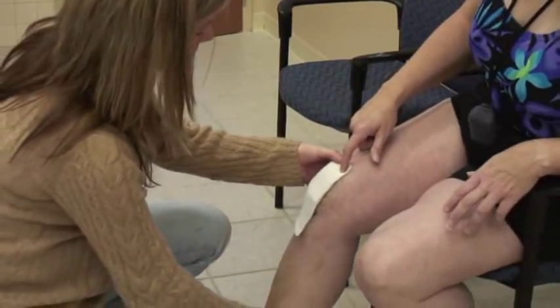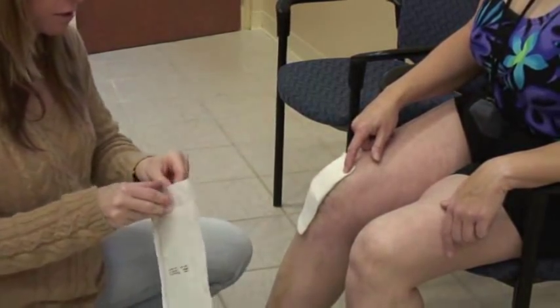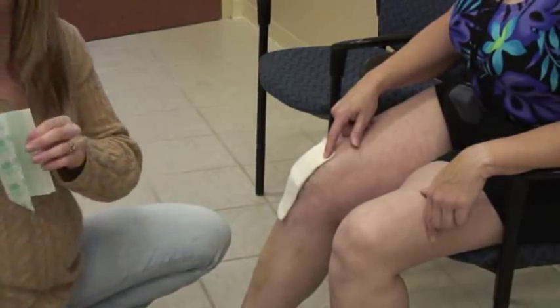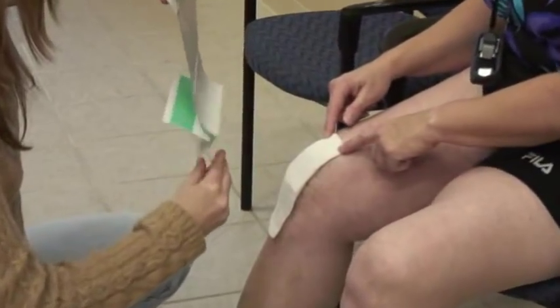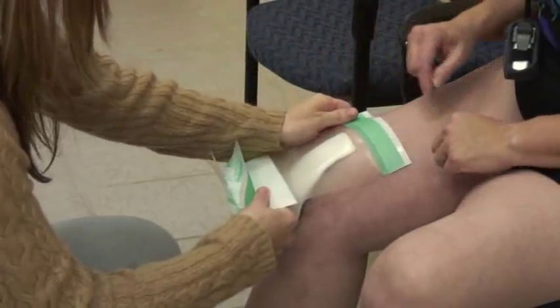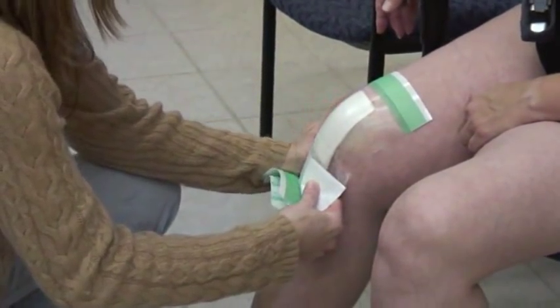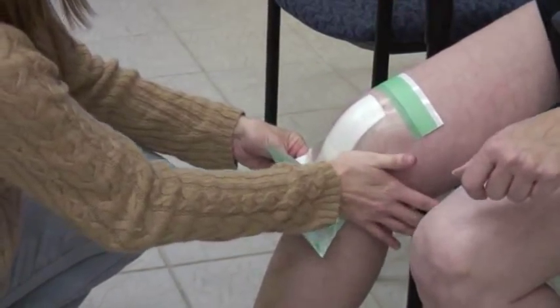Can you bend back just a bit? We'll have her flex her knee as far as she can so that the first time she flexes her knee in the water it doesn't blow the op-site. We make sure we create a really good seal so that there are no wrinkles that go all the way to the center of her incision, or else it creates a little channel for the fluid.